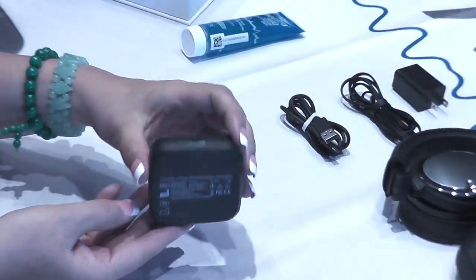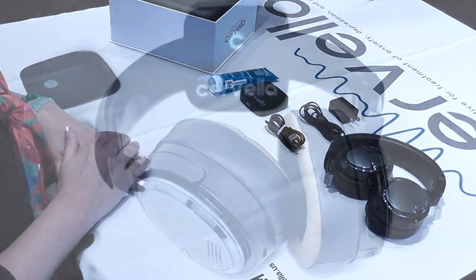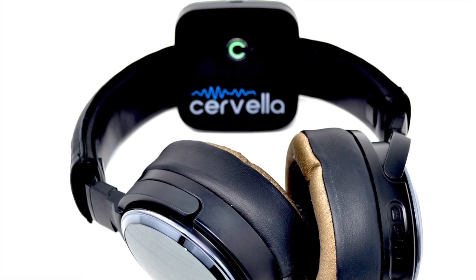Notice that there are no on-off buttons on the Cervella device, as it wakes up and goes to sleep when it receives a Bluetooth signal from the Cervella app.